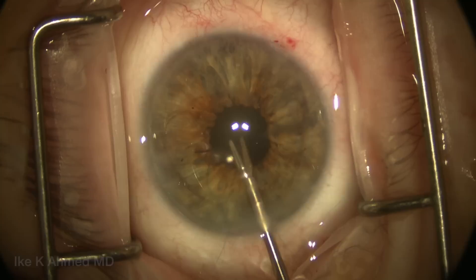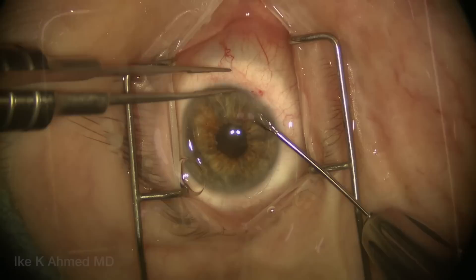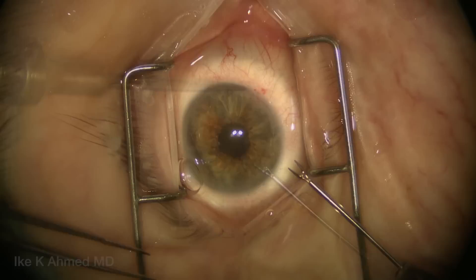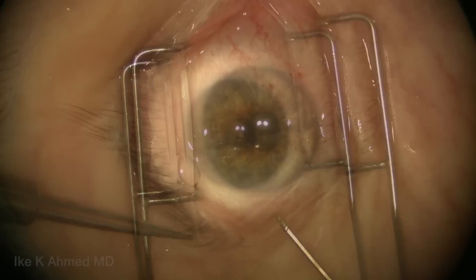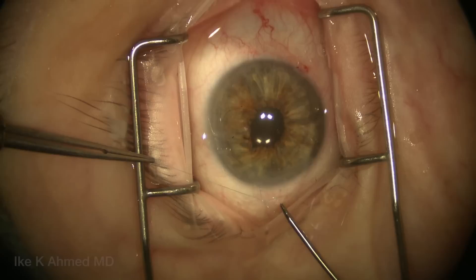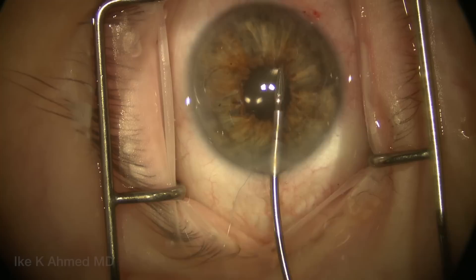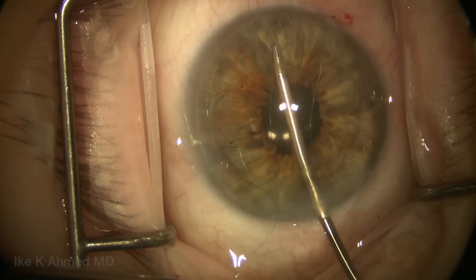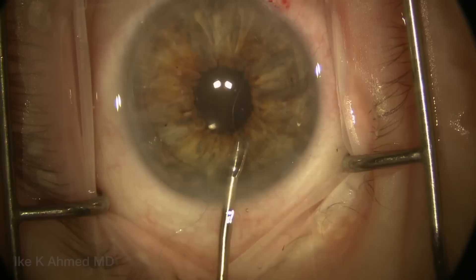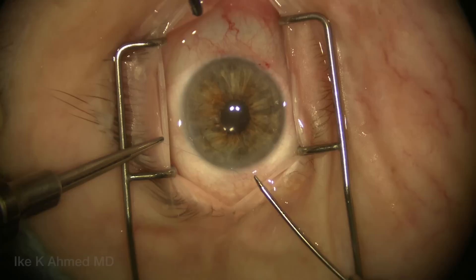A 3.5-millimeter pupil size gives the best balance between reducing photophobia and allowing adequate visibility of the posterior segment in mesopic light settings for cosmesis. We pull the short end out of the eye, keeping it relatively short for easy maneuverability into the anterior chamber. A single throw in the reverse direction is made to lock the knot, using the micro tyer to bring it into the anterior chamber and pull tight to lock the knot onto the pupil edge. This is the modified mechanical technique, also described as the Mikama technique, combining the benefits of external mechanical suture throwing with the internal micro tyer control within the anterior chamber.